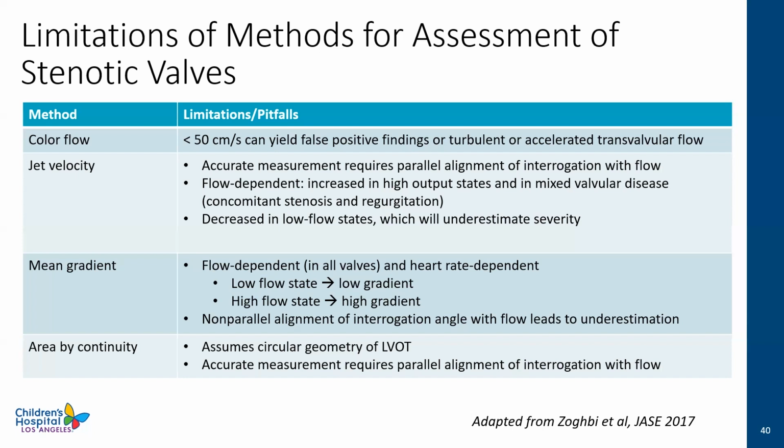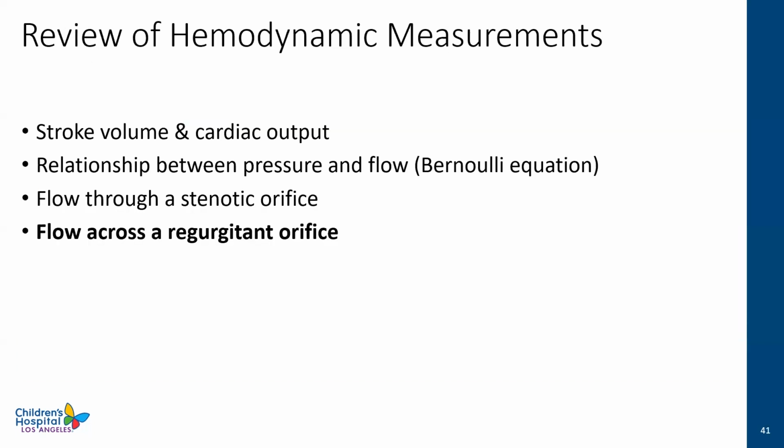And then for area by continuity, using the continuity equation, you're assuming a very circular geometry of the LVOT, which it may not always be. And you're also requiring parallel alignment of that interrogation.